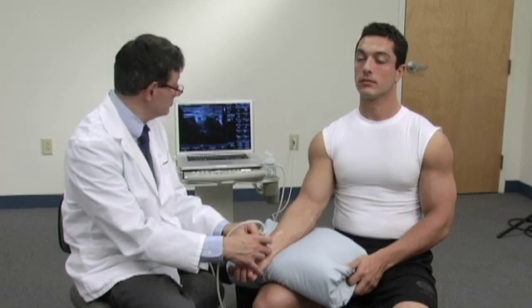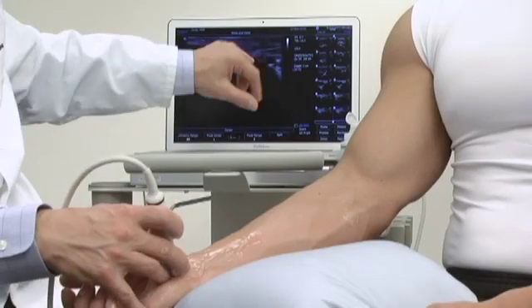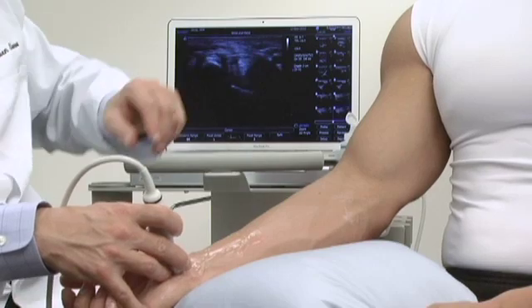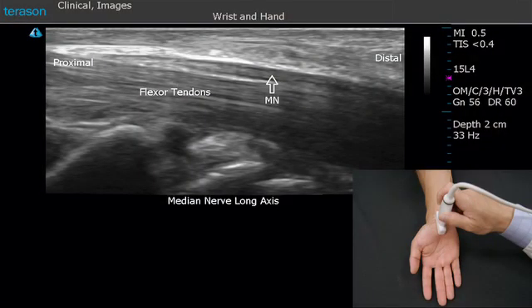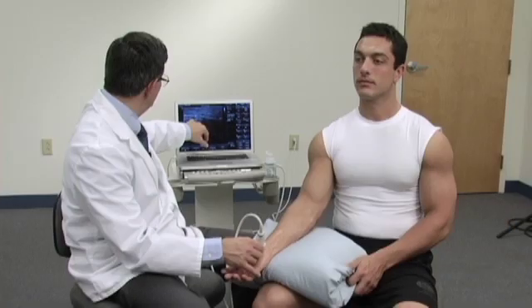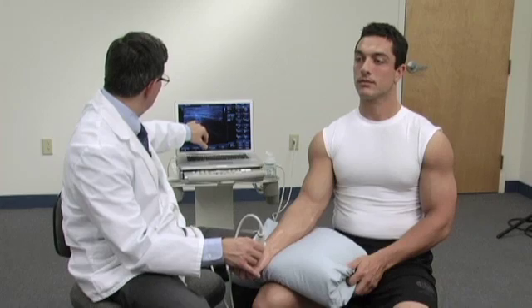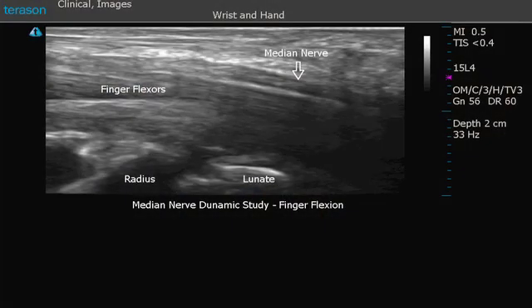From the short axis view of the nerve, we're going to rotate the probe 90 degrees to view the nerve in its long axis. Here's the nerve, and I'm going to slowly rotate the probe in an attempt to elongate that structure. The nerve will usually appear hypoechoic relative to the tendons, and if you have the patient bend their fingers slowly, you'll see that the tendons move in relationship to the nerve.